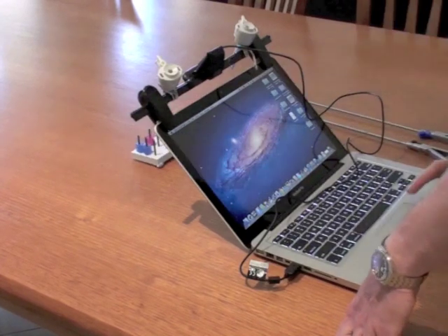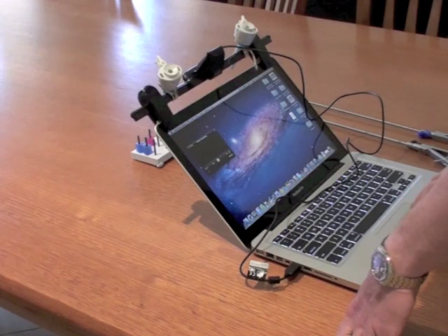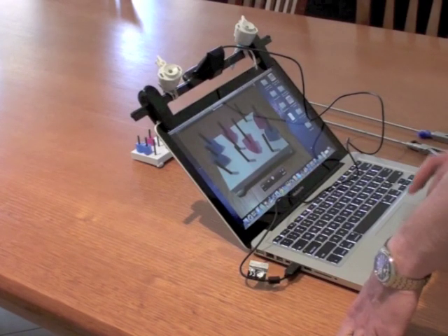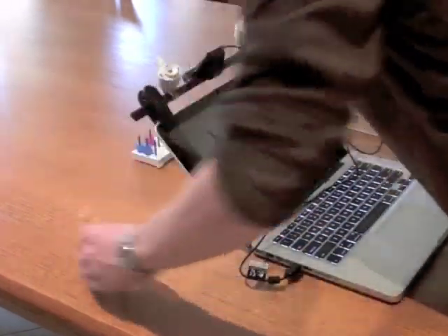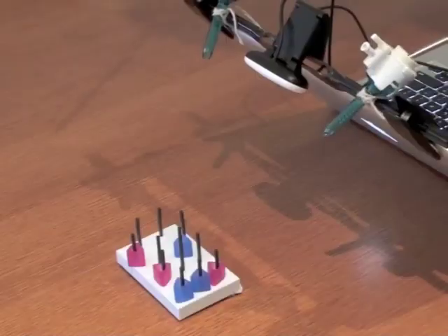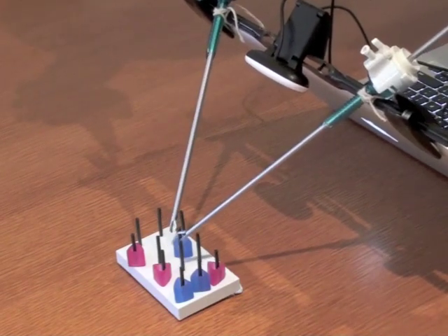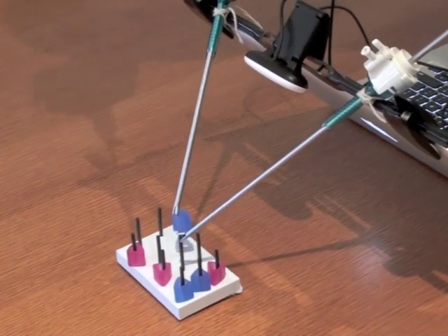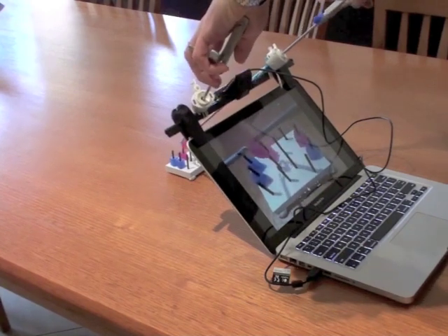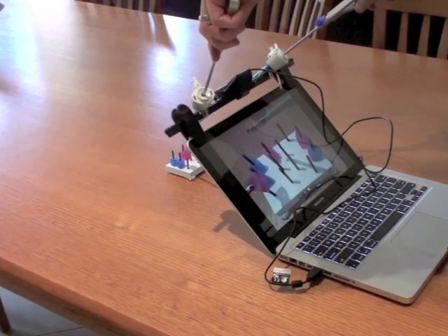The advantage of using QuickTime is that it's very easy to come across, it's free, and you can record your videos as well. And now you can use your portable laparoscopic simulator to practice dexterity, tasks, knot tying, whatever you desire. That's pretty much it.